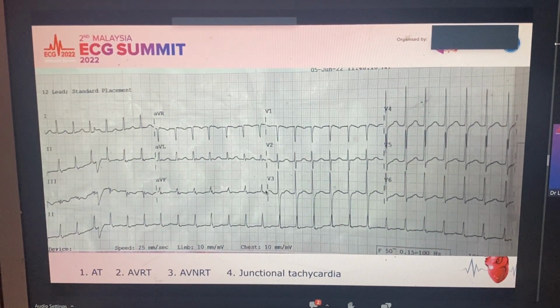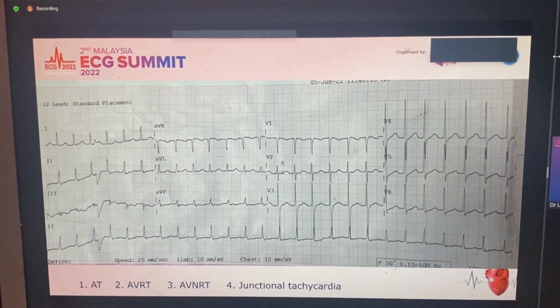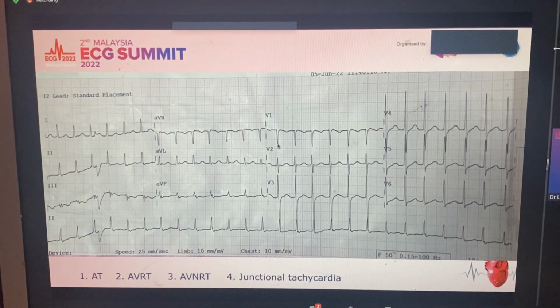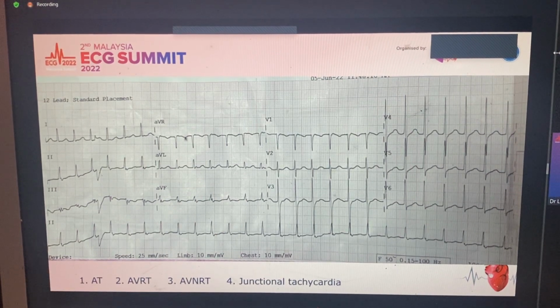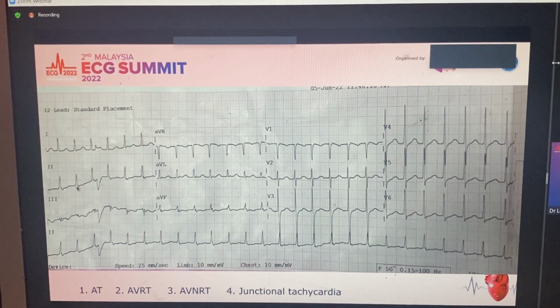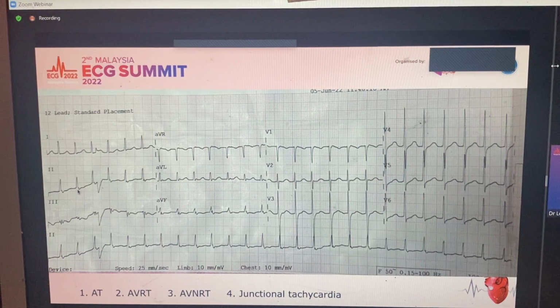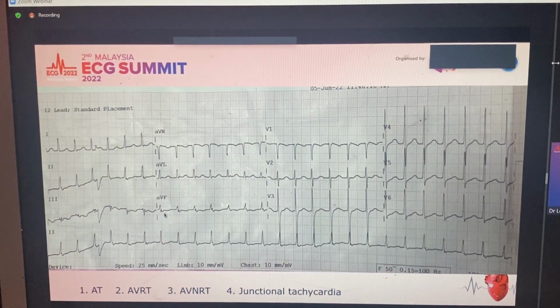As we have mentioned earlier, if you do not have the initiation or the termination of tachycardia, you look at the QRS and the P wave relationship. So it's more like a P wave hunting exercise here. You go through the chest leads and the limb leads to look for P waves. Here, I think the P wave is most clearly seen in the inferior leads, where after the QRS there's this small negative bump, which is very peculiar for a QRS complex.